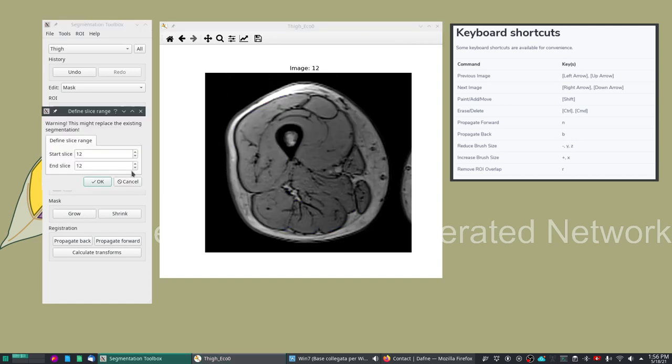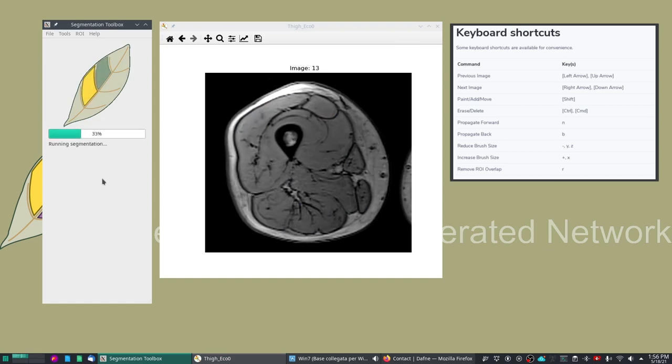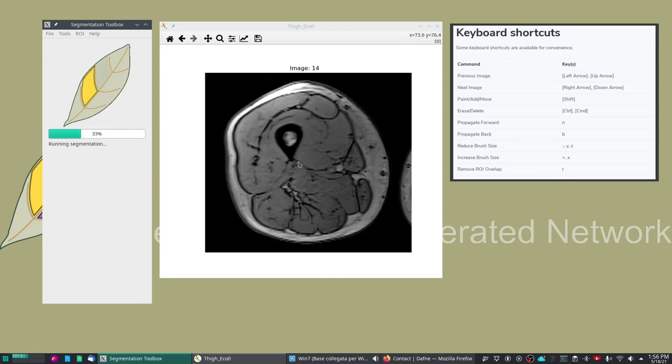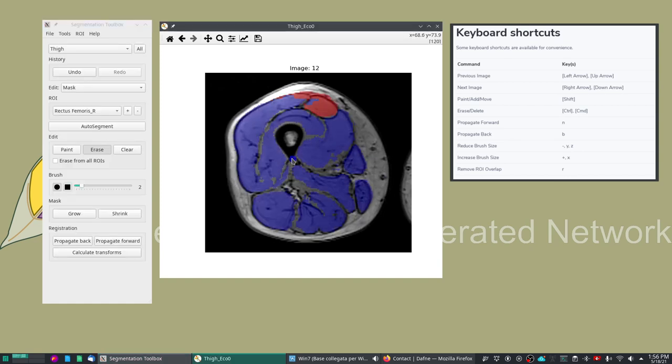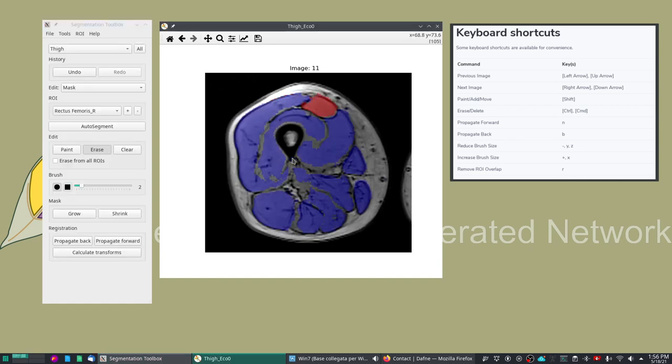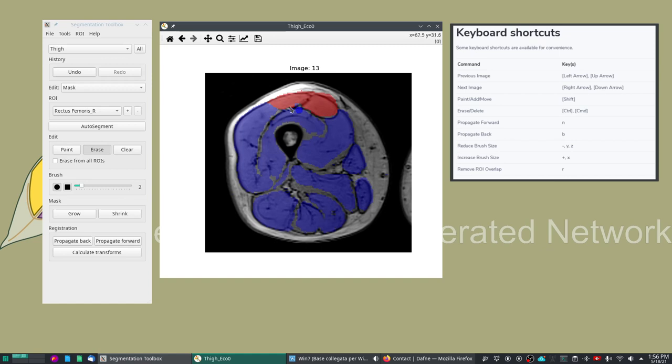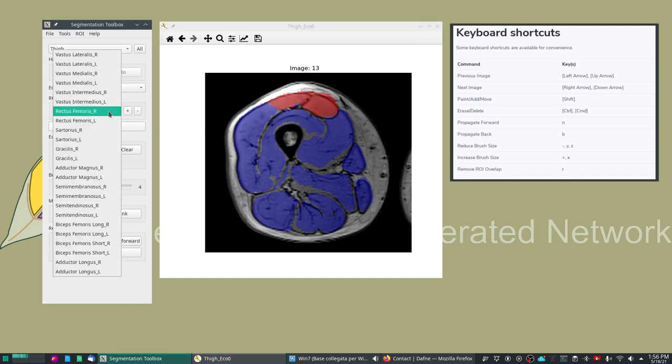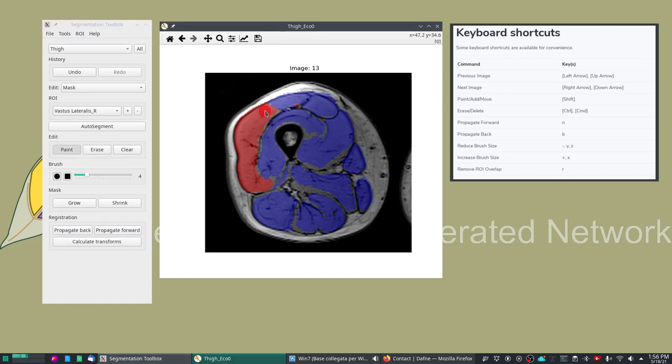This is it regarding the automatic segmentation. Of course we can do an automatic segmentation on more slices. Let's do a couple more slices. In this case the rectus femoris has been quite grossly overestimated so we need to do some modifications.